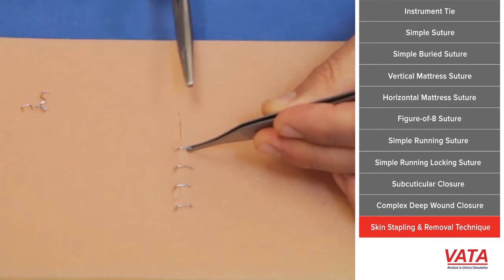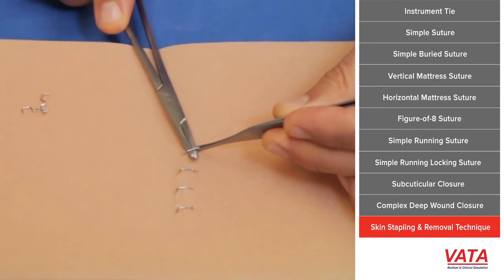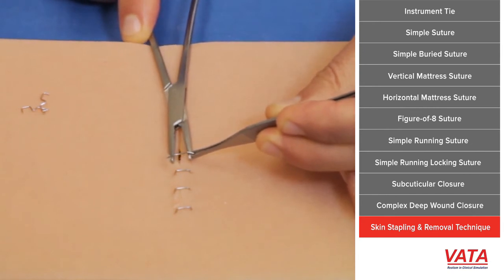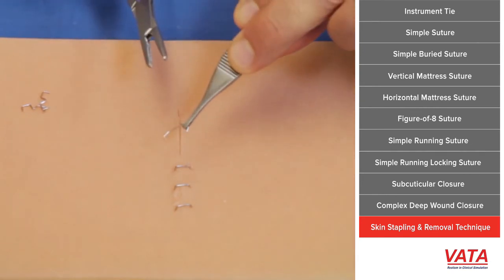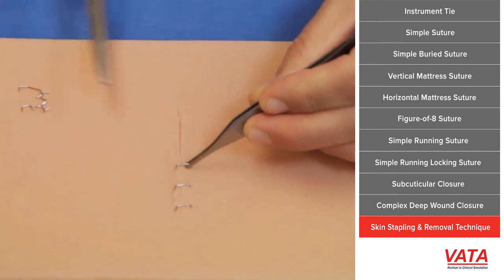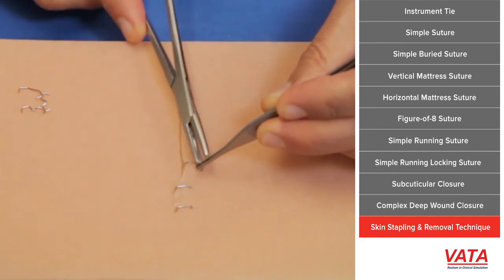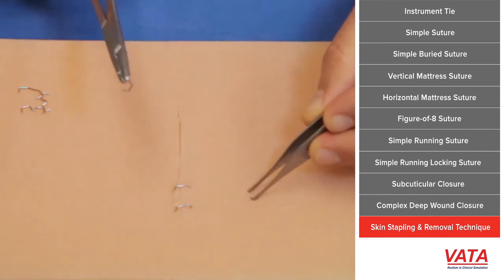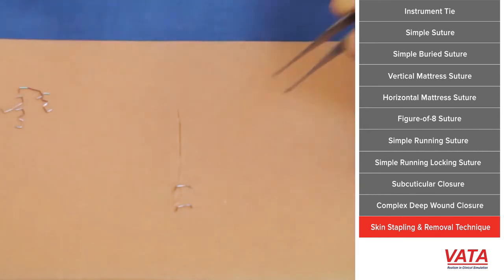Sometimes if the bending apparatus doesn't really straighten them completely, you can just, as you're stapling, rock it gently. And here's an example with just a needle driver where literally you just spread, so you're trying to open those tines, and as it does, it'll come out. If you're going to do this, it's usually better to do this on a patient who's asleep, because it can hurt to remove staples this way. And again, sometimes you do need to kind of rock from side to side.